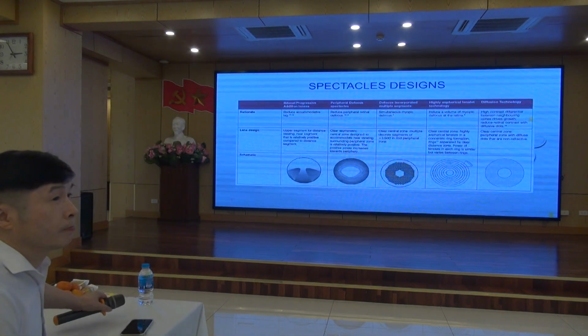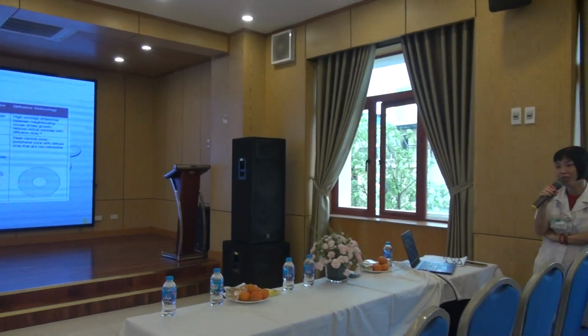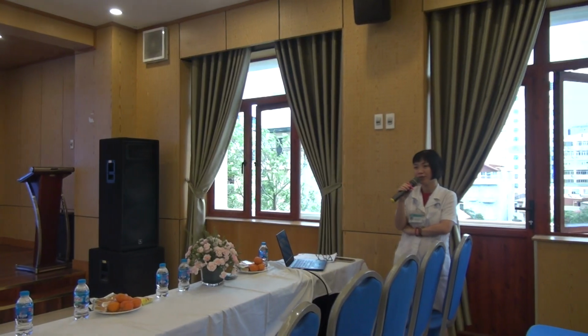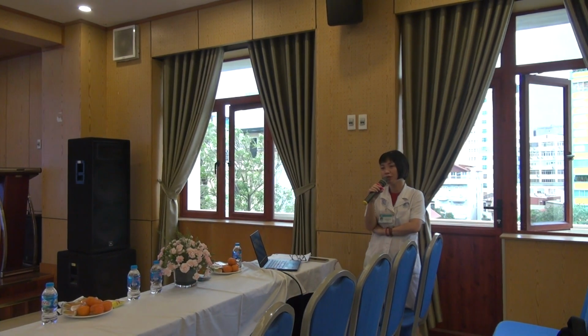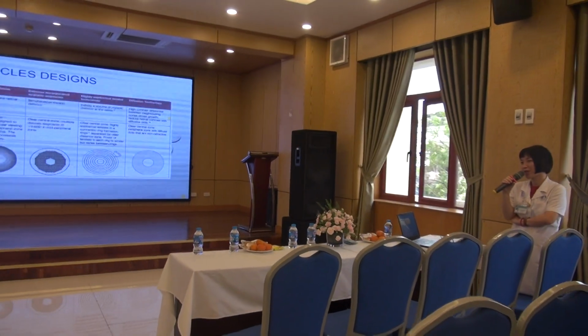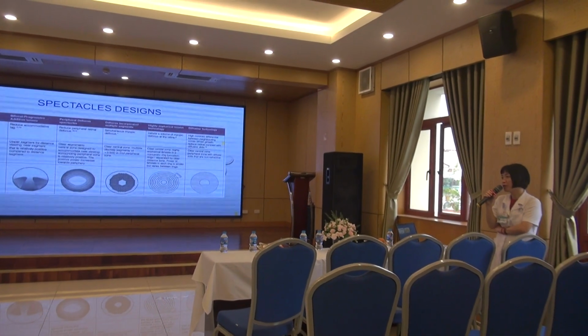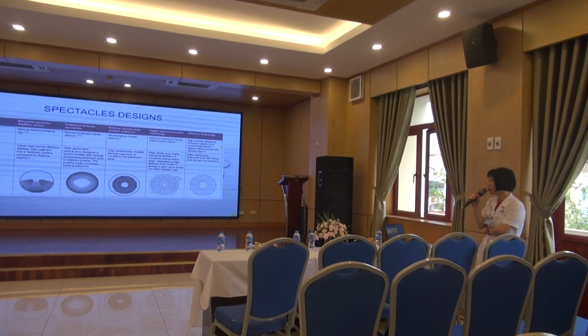I started using Ortho-K around 10 years ago to control myopia. But how about the result? You compare with not, about the result of myopia control with Ortho-K.